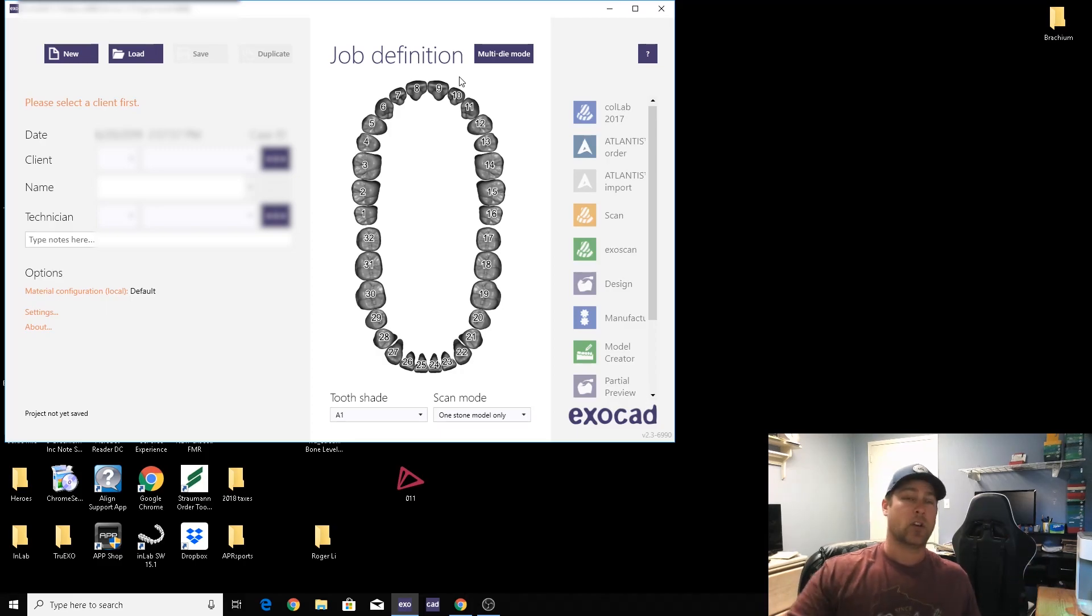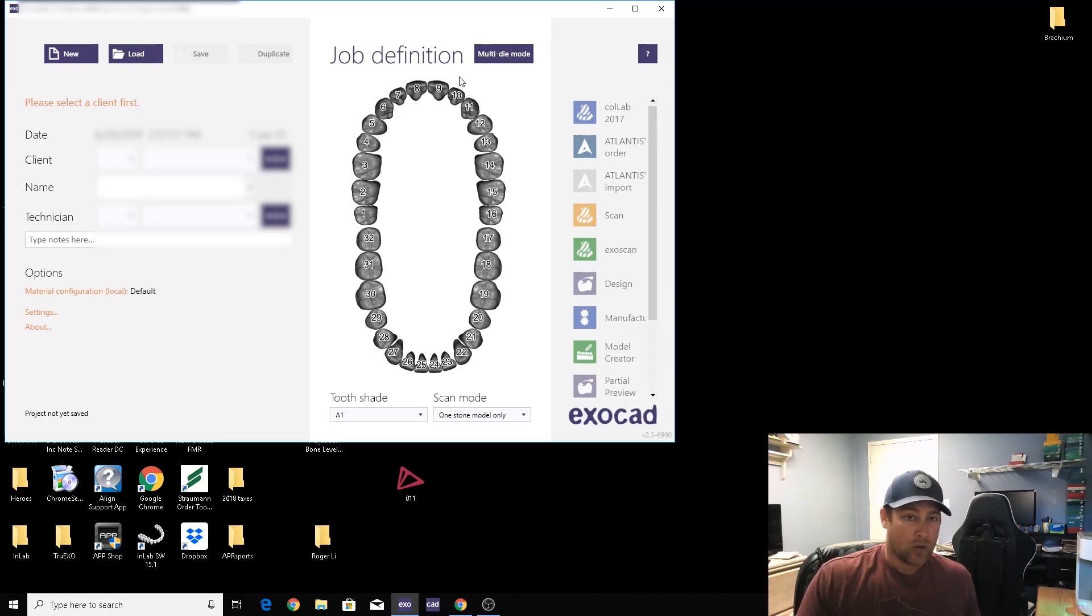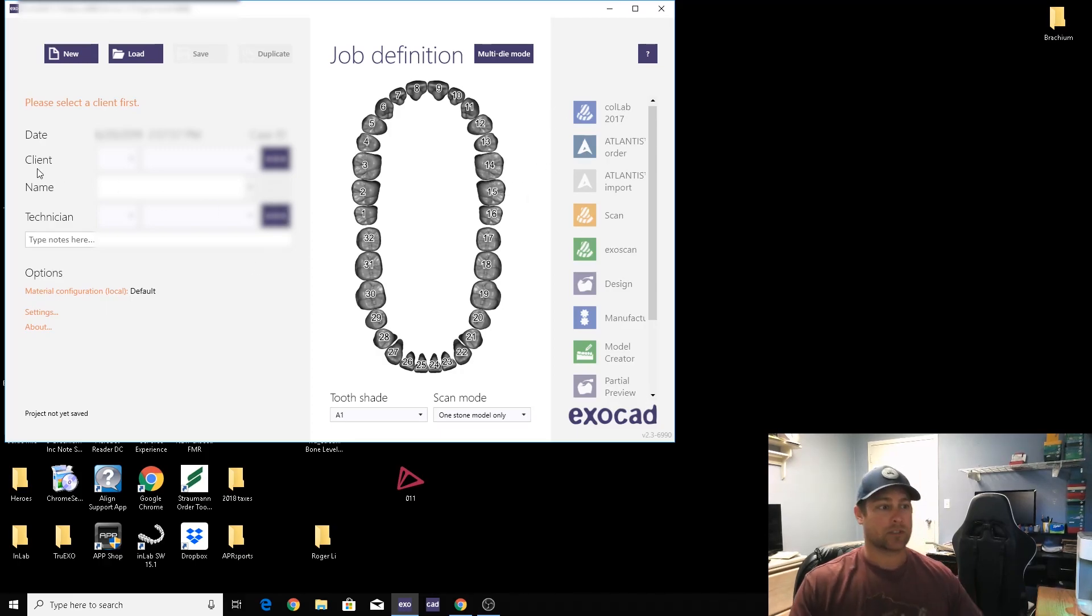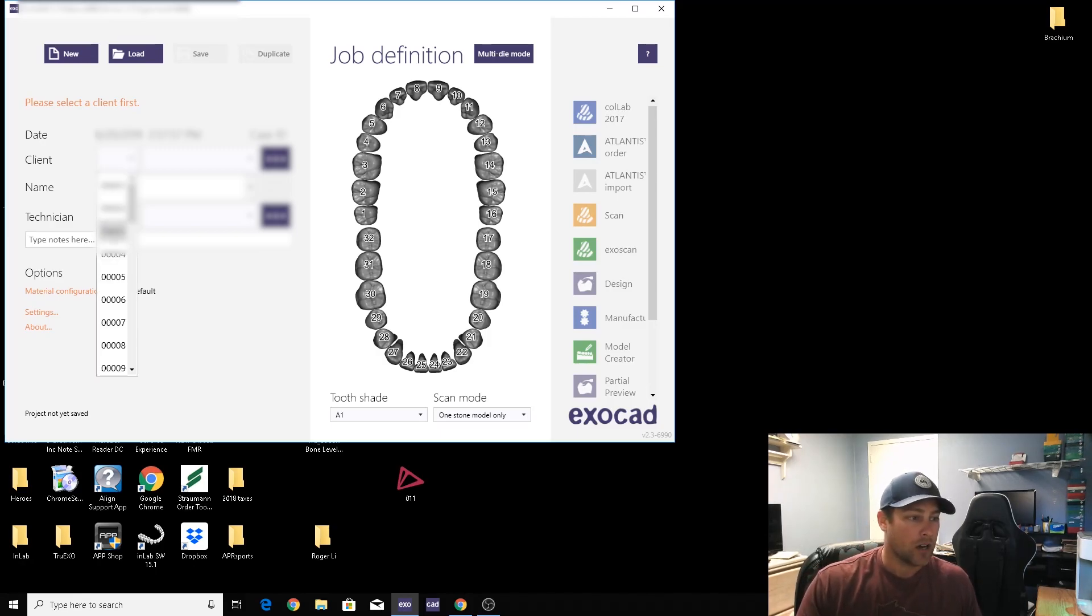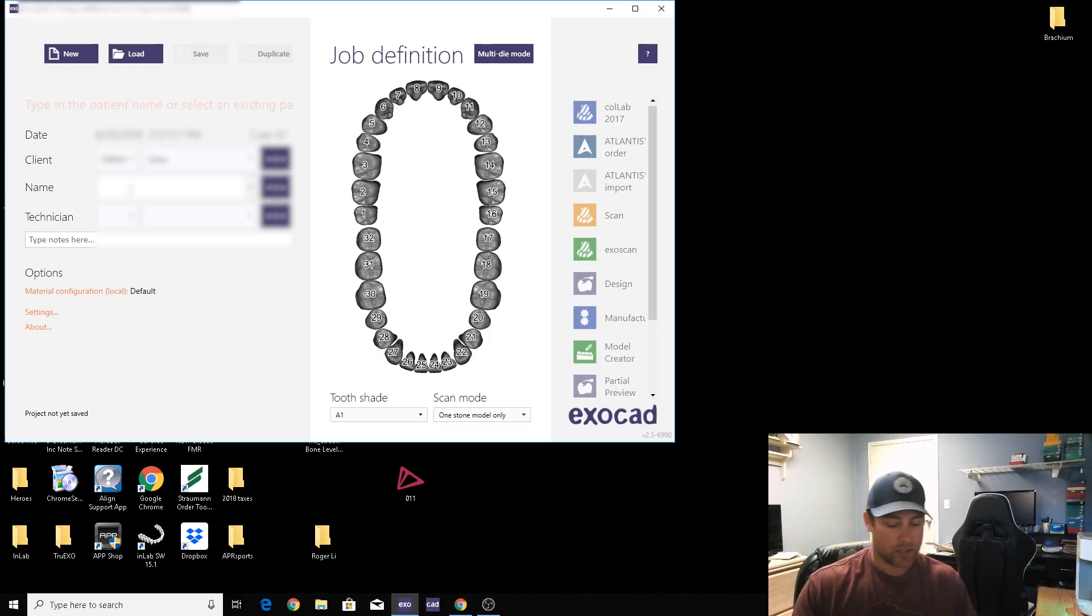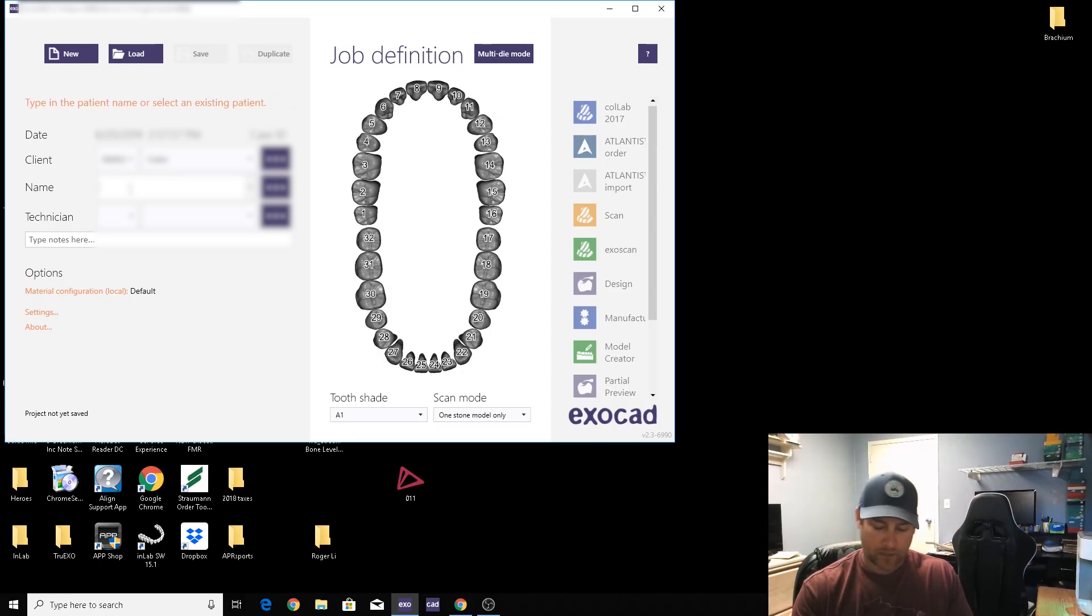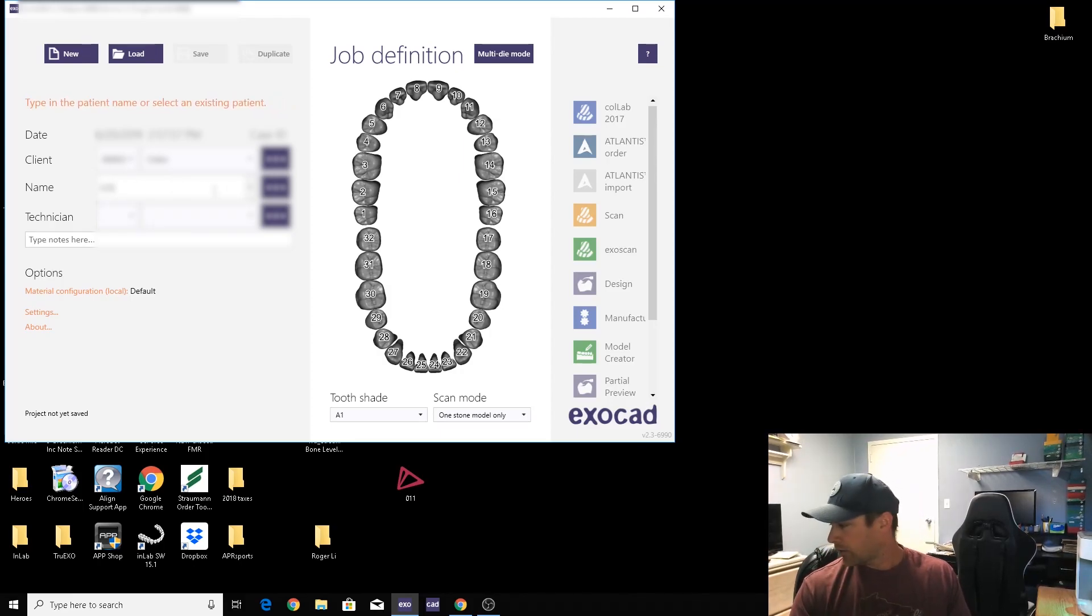It all fits into the implant like they're supposed to, just like a transfer coping. So there's only going to be one scan body that fits one certain implant size and implant system, so it's not like a universal scan body for everybody.